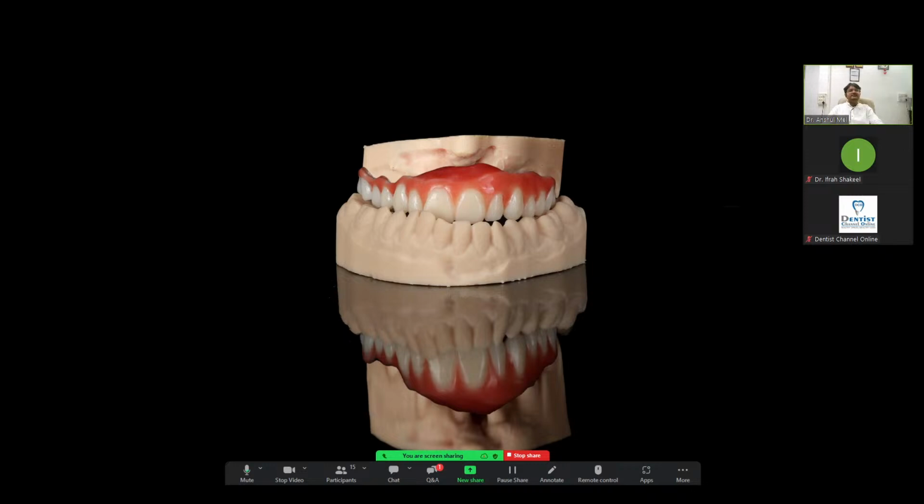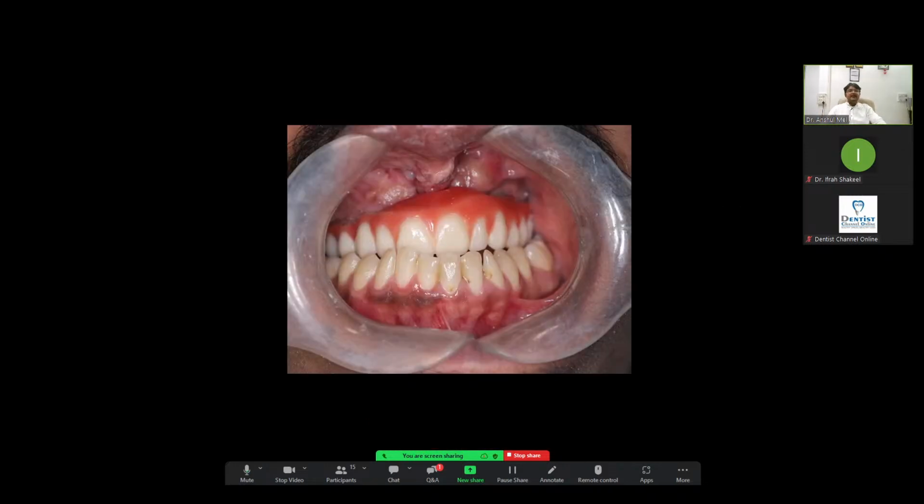If anything happens to the zirconia, we can take out the top zirconia, keep my bar as it is inside the mouth, and then reload the new prosthetic, because we have stored the data. This is one more advantage of digital. One is maintaining the same bite. The second is the futuristic aspect: we have the data, so we can use the same data for a future prosthetic if anything happens. So this is how we create the bridge, and this is the post-operative of the same case.